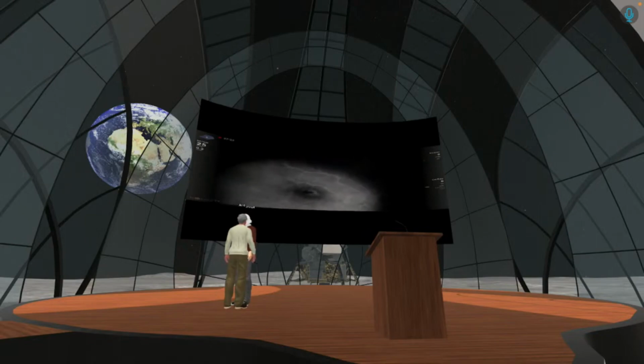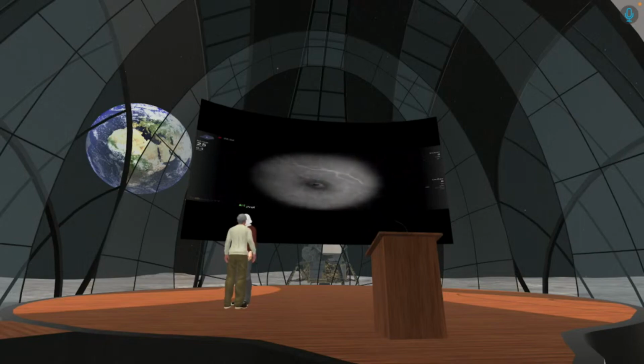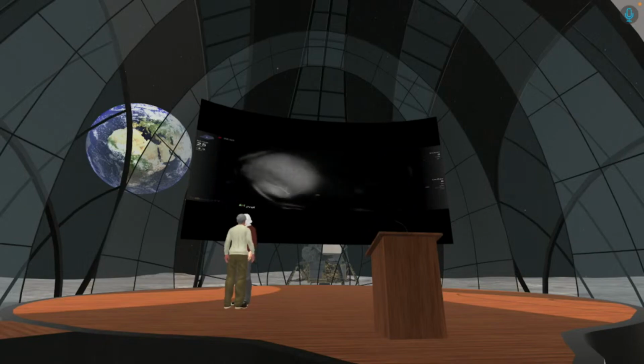And what's your light source filter wavelength? It's 490 nanometers with 30 nanometers bandwidth. Is that the IDEX one or is that another? No, I'm not sure, but probably it's a Semrock BrightLine.